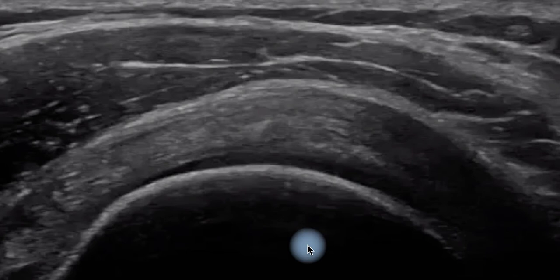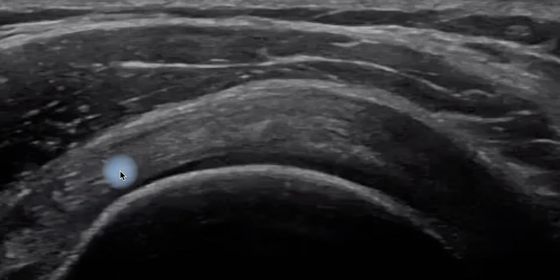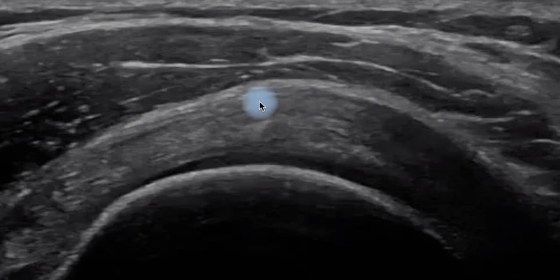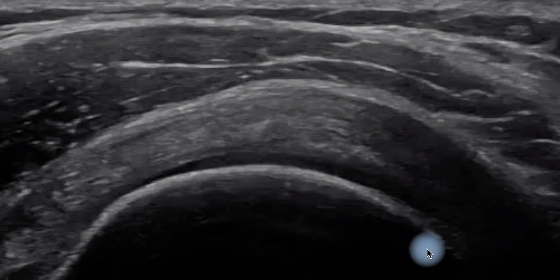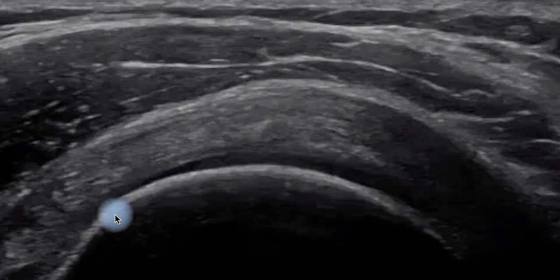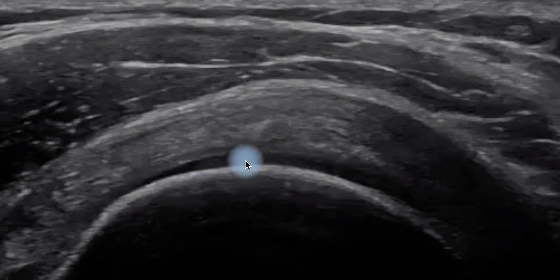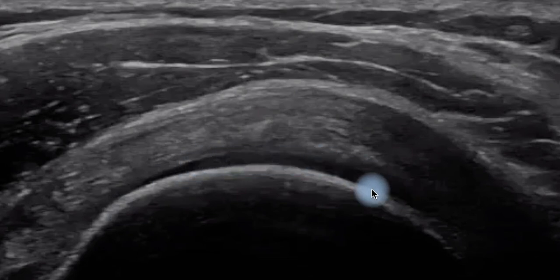Just to orientate you to what you're looking at here: this is a cross-sectional view of the supraspinatus tendon. This is the tendon structure itself, and underneath it you've got the bony outline of the humeral head. The top white bone is the cortex of the humeral head and greater tuberosity, and on top of it this hypoechoic or dark area is the articular cartilage.